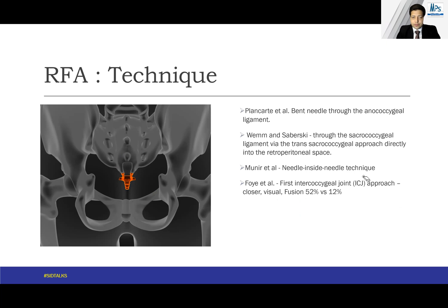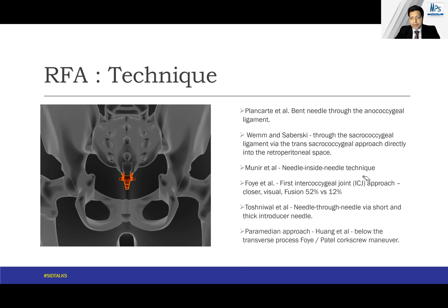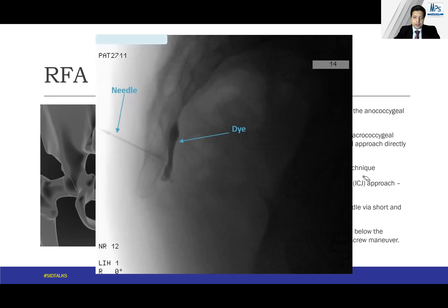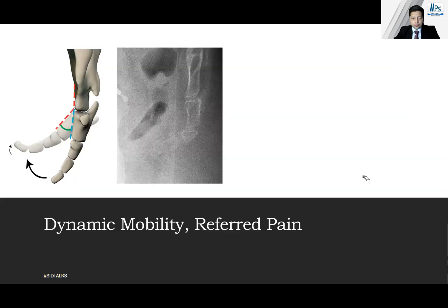C1–C2 is another possible approach, and Toshniwal et al. used a needle-through-needle technique with a short thick introducer needle. A paramedian approach is described by Huang et al., going below the transverse process. Foye and Patel added the corkscrew maneuver to this technique. In the lateral picture, the needle crosses through the disc, and once it reaches the correct position, a comma-shaped dye spread is seen, indicating proper placement, after which RF or whatever intervention you want to do can be performed.